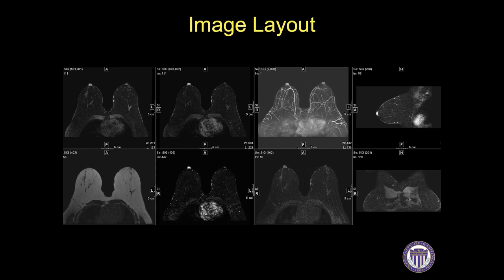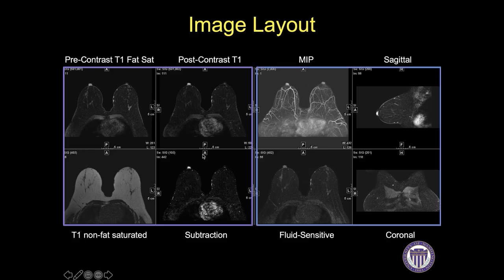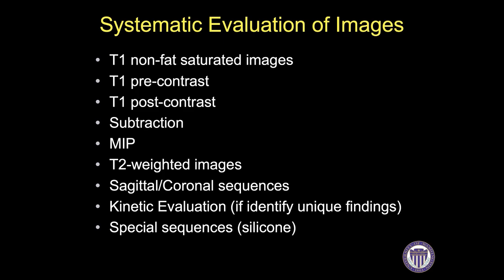For systematic evaluation of images, I will show you a method of reviewing the sequences with the layout we use at the University of Washington. In general, we have pre- and post-contrast images on the top left, T1 non-fat saturated images on the bottom left, subtraction images next to that, and on the right-hand side, the maximum intensity projections or MIPs, sagittal and coronal images, and our fluid-sensitive sequences. Everyone has their own algorithm, but you need to be systematic and consistent.